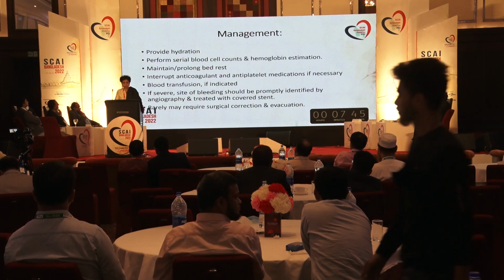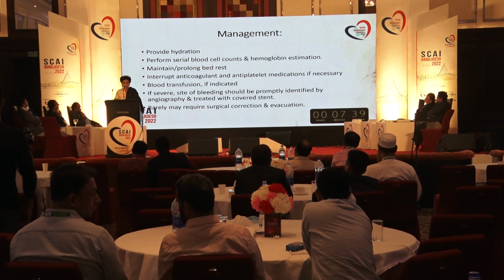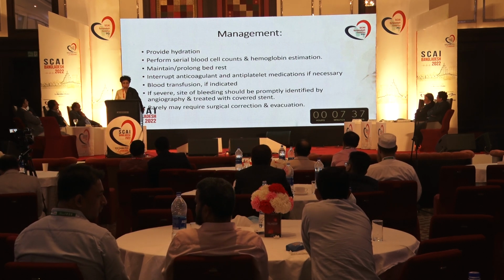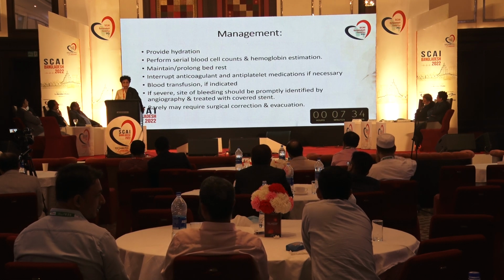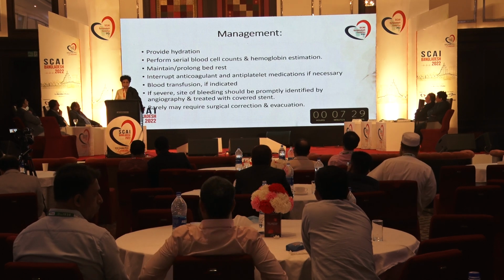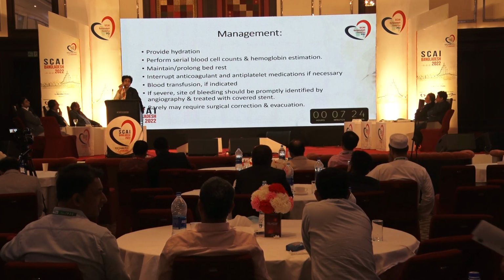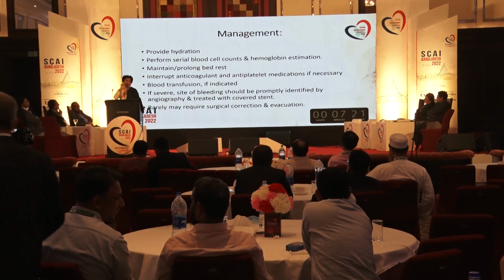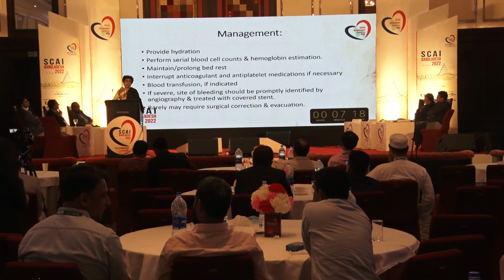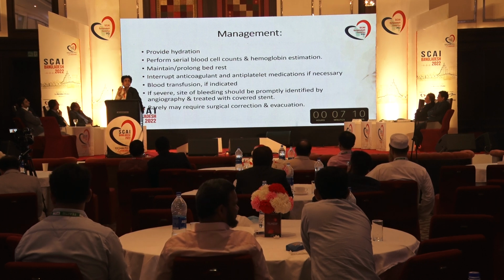So management, obviously you start giving the patient fluids, you arrange for blood and you give the blood transfusion. The patient has prolonged rest, and you may need to interrupt the anticoagulation and antiplatelet if required. And in severe cases like in our patient, we have to give a covered stent. In another case, what we did is, it was a small jet of blood coming. So we took a peripheral balloon, inflated it to low pressure and kept it for 10-15 minutes, and the bleeding sealed by itself. So if it's a very small bleed, maybe you can seal it with the balloon.